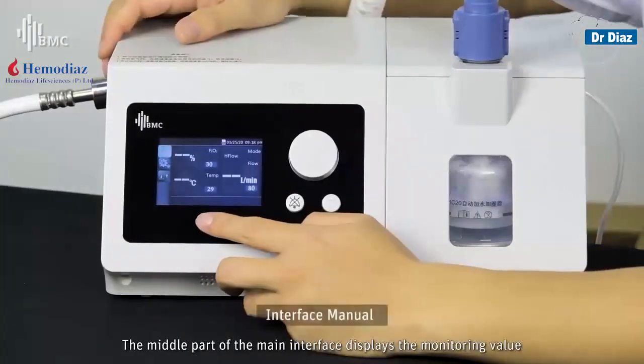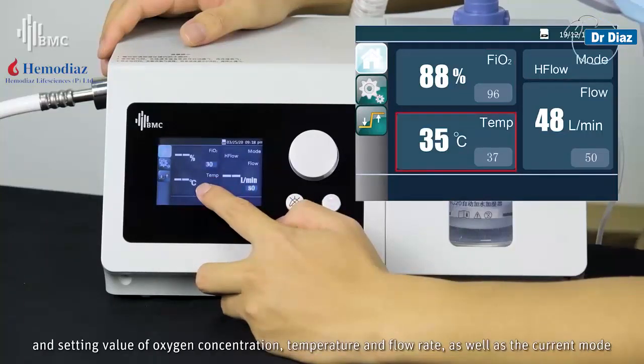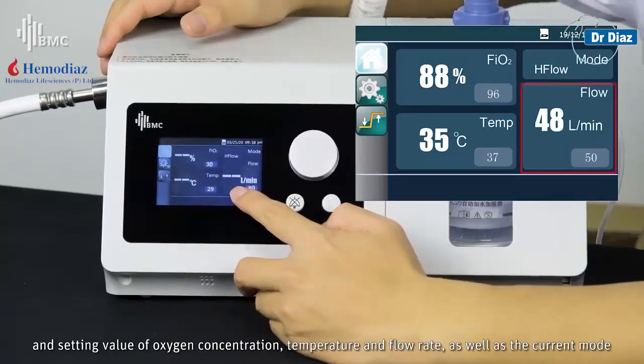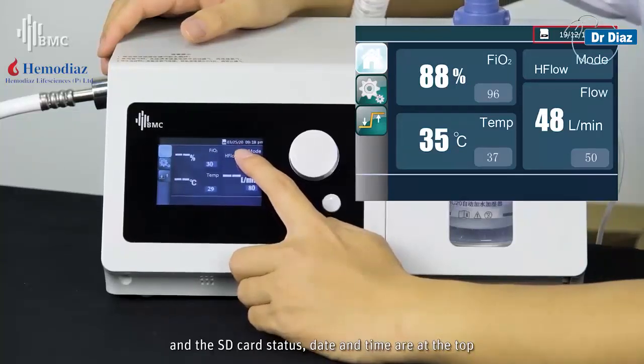The middle part of the main interface displays the monitoring value and the target value of the oxygen concentration, temperature, and flow rate, as well as the current mode and the SD card status. The date and time are displayed at the top.